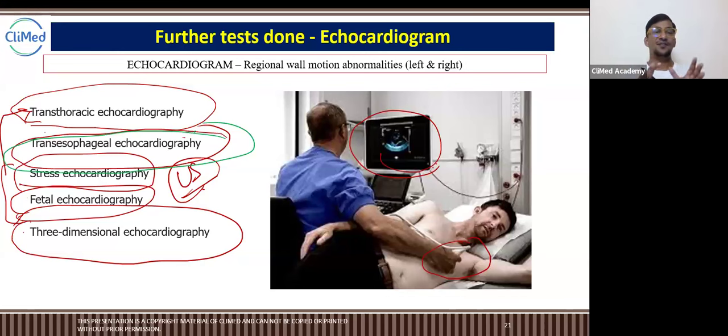First, if we look at how it is being done, we give some anesthesia, which makes our throat numb, so the probe is not hurting us, or we cannot sense the probe. It goes inside, it checks the sounds, and it gives us a more precise and clear picture on the screen.